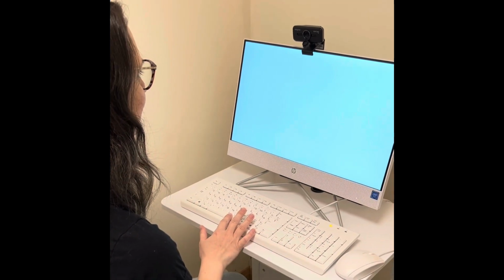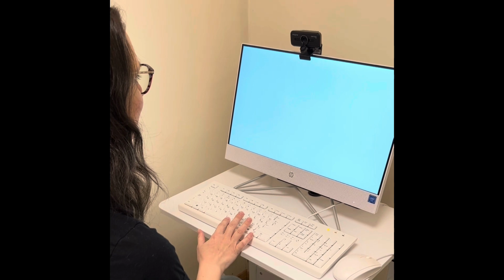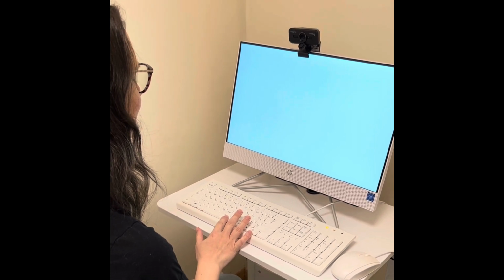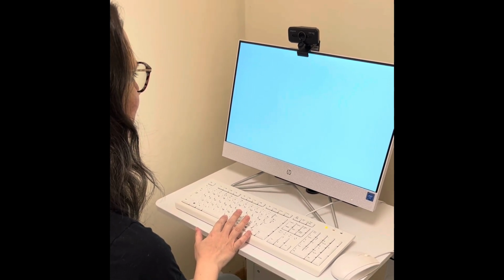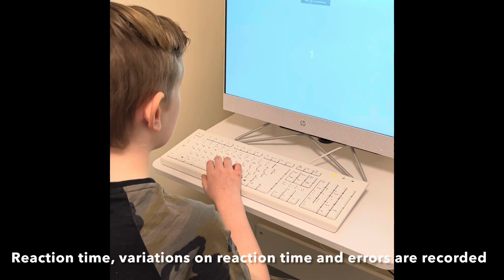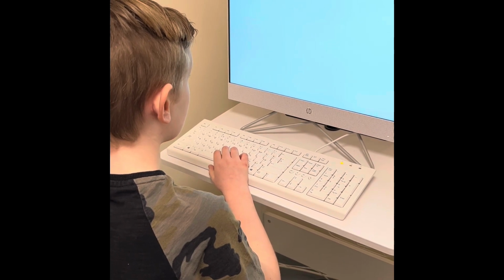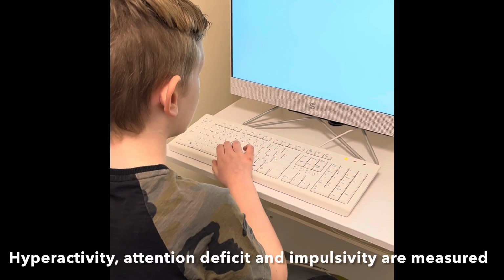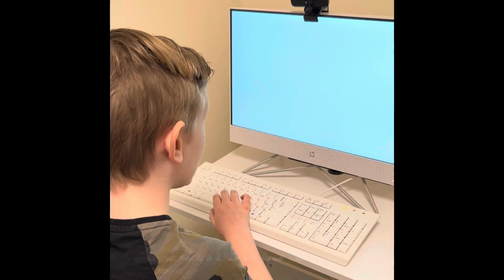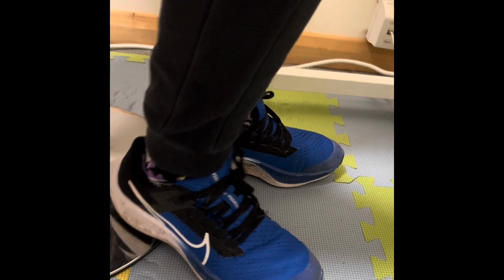The test is extremely boring, but the important thing is to do your best and be yourself. I will be sat just to one side of you, taking notes of my observations throughout the test. The software records how we process information relevant to tasks such as remembering phone numbers, directions or essay writing, as well as measuring levels of activity. It can measure body movements that may not be obvious in a classroom, for example.